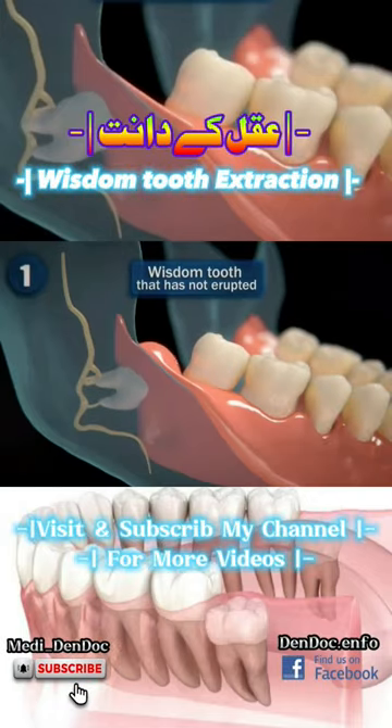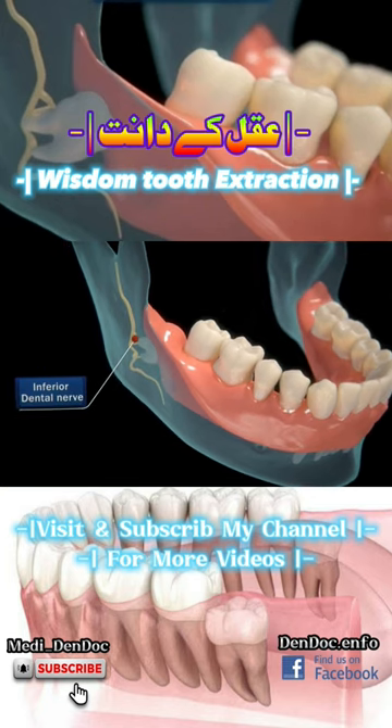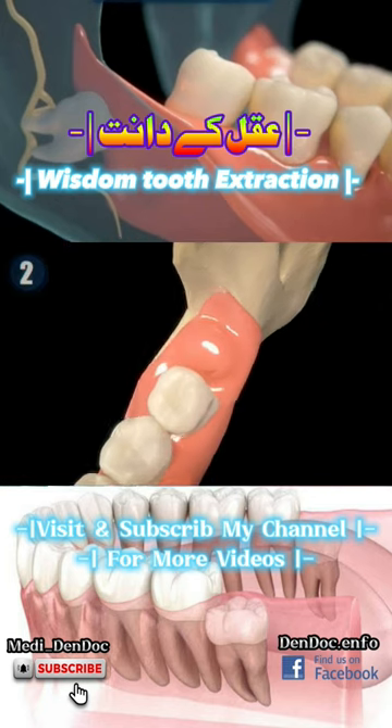To extract a wisdom tooth that is not erupted, the dentist will perform a nerve block technique to the inferior dental nerve in the area where the anesthetic will be applied, ensuring that the area is completely numb.